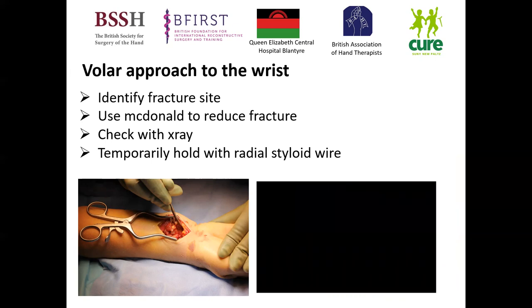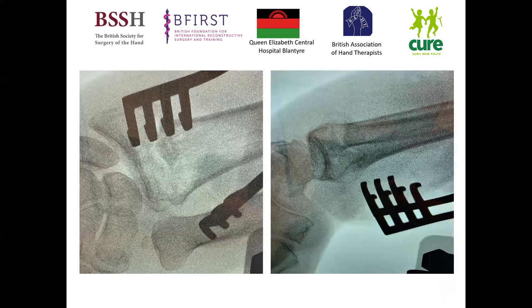In this situation, you can see how we've got the radius exposed and the fracture line exposed. I pass a McDonald elevator through the volar and dorsal fracture lines, which helps aid my reduction. I can pull and translate using a technique similar to the Kapandji technique, bringing that dorsal fragment back in, and also manipulate as needed. Once I've done that, I temporarily hold the fracture with a K-wire running through the radial styloid, which makes my plating easier to perform.